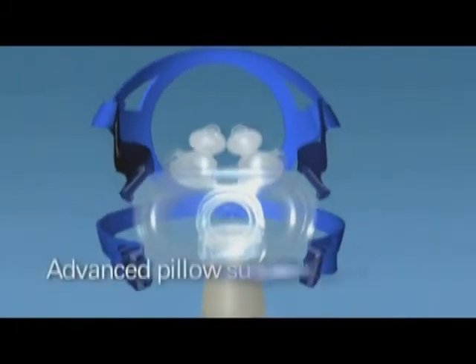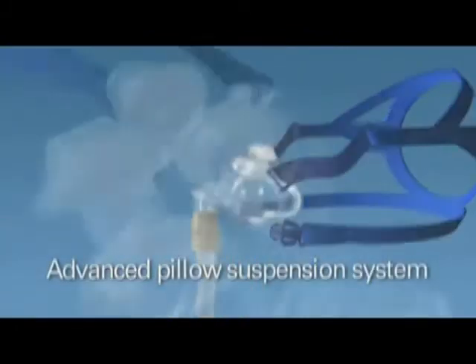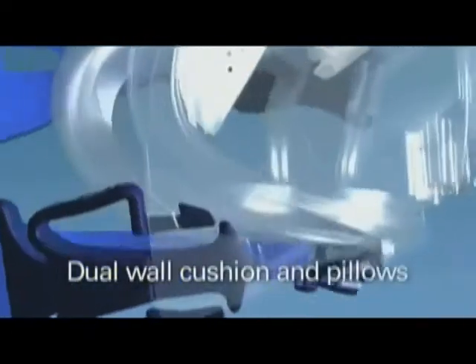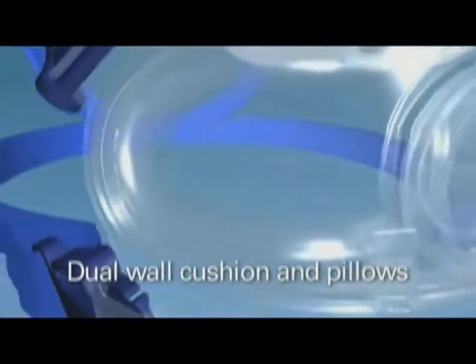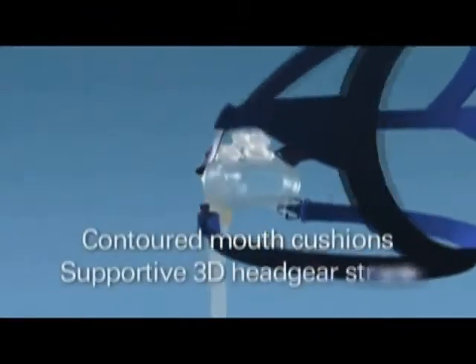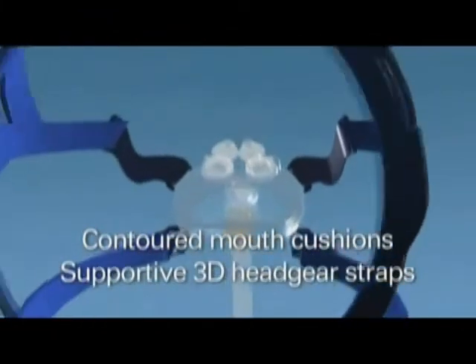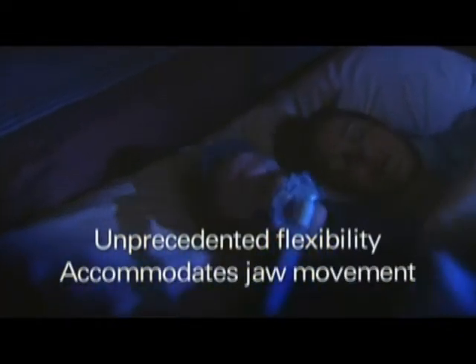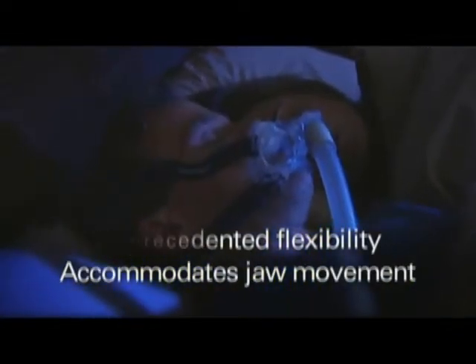Mirage Liberty's state-of-the-art engineering delivers superior comfort from an advanced pillow suspension system, exceptional seal from ResMed's ultra-compliant dual wall technology, and helpful stability from contoured mouth cushions and supportive 3D straps on the headgear. The mouth cushions also offer unprecedented flexibility and are designed to accommodate jaw movement.